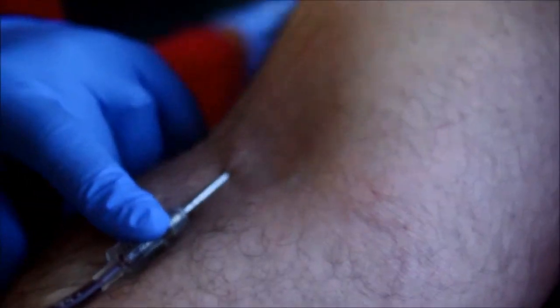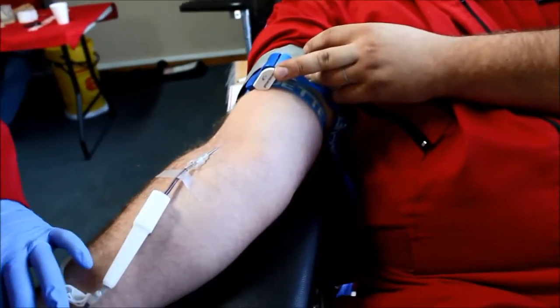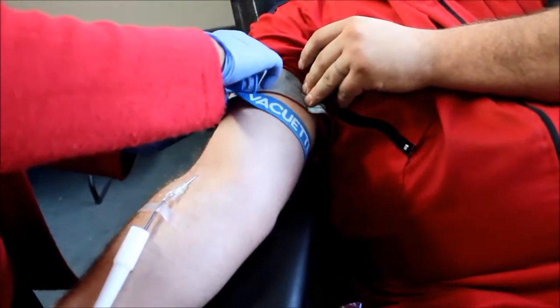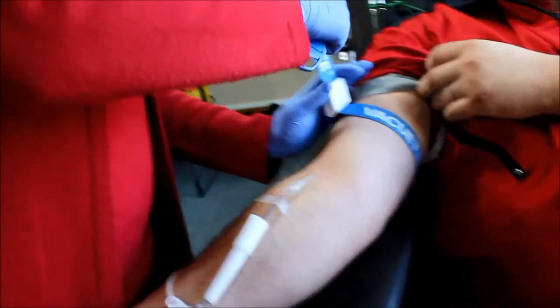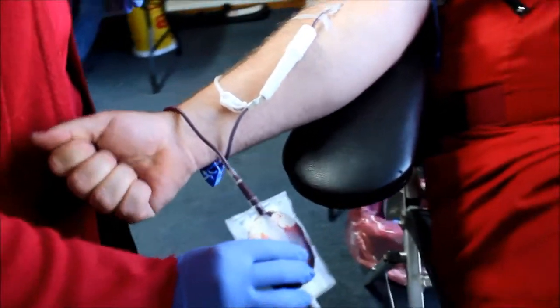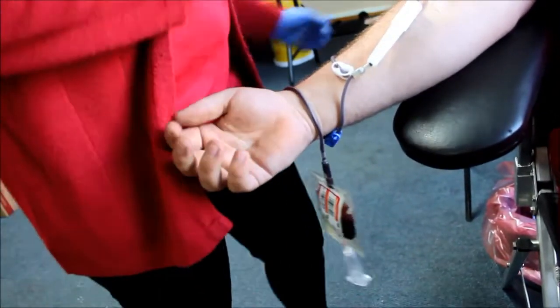Does it hurt? Good. Then I just need this. And then you loosen the tourniquet. If you find a good flow, tighten it again so that it goes faster. And then you must just make a few good squeezes. And if this is enough, I just close here, then open this big one.